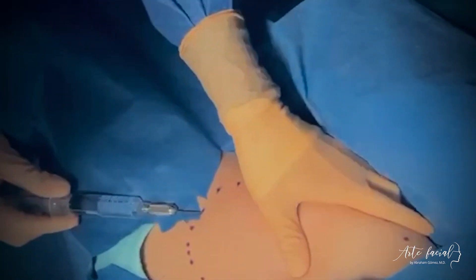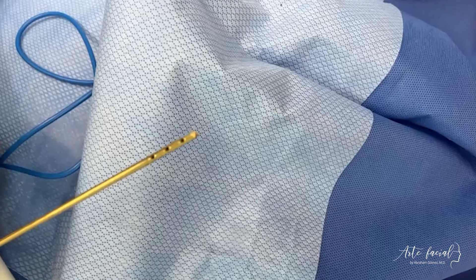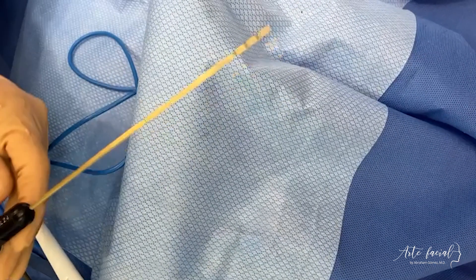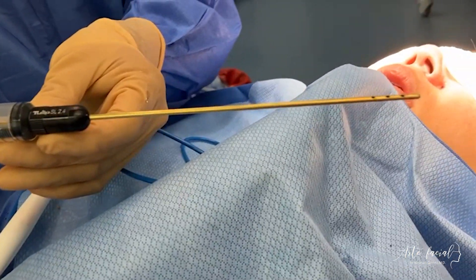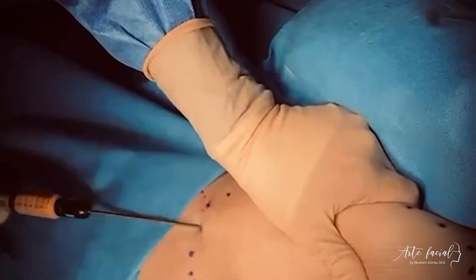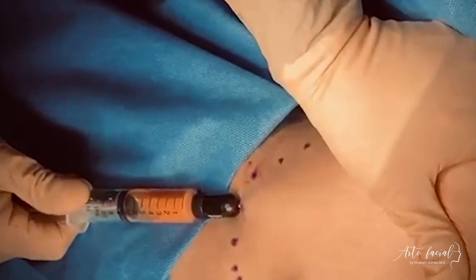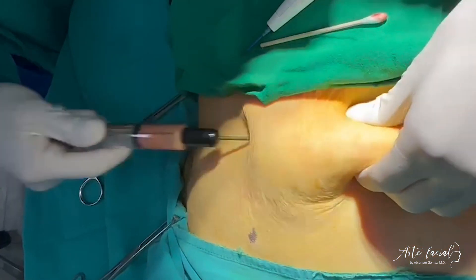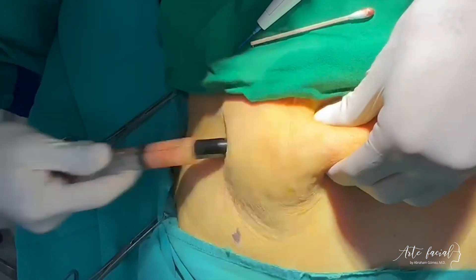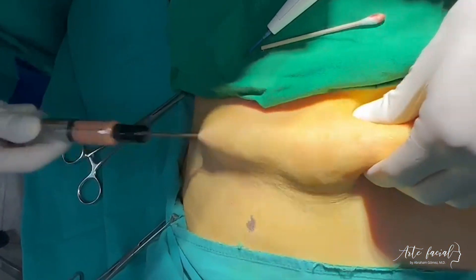After a few minutes, the fat is harvested. This is done with a special harvesting cannula. Gentle applied suction by means of a 10 milliliter syringe attached to the cannula allows efficient fat harvesting. Over-harvest is important as the fat is mixed with blood products and anesthetic solution.